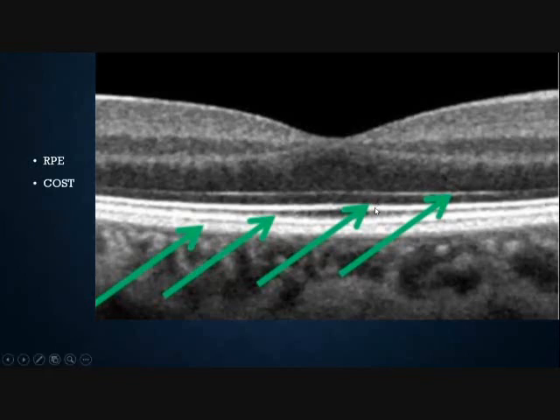And the third is the ISOS junction, ellipsoid junction. This is the ellipsoid ISOS junction. So this was taken very seriously previously because any disruption in the ISOS zone was clinically found to have decreased vision. Okay, and the external limiting membrane, ELM. Good. So now you are master of OCT.